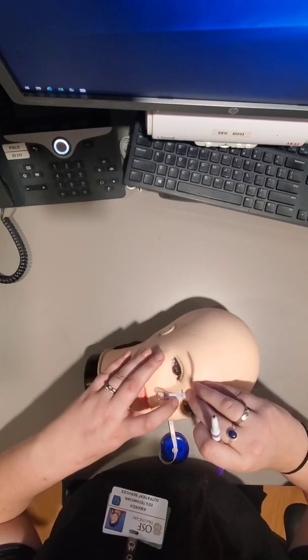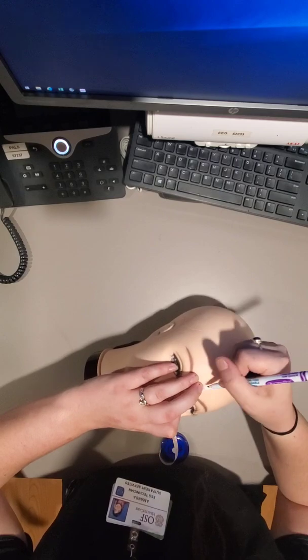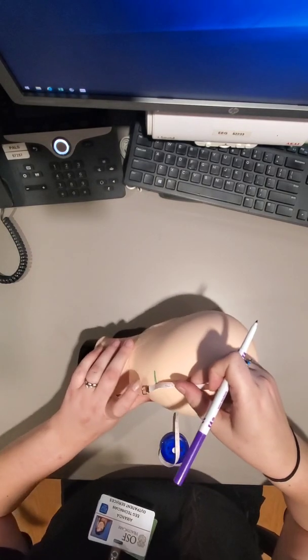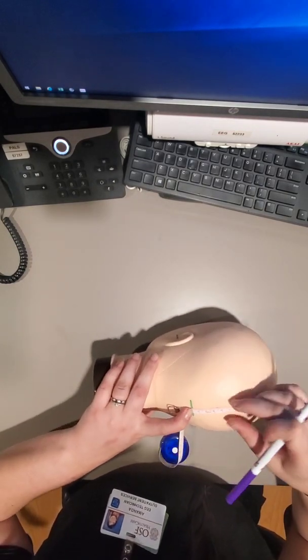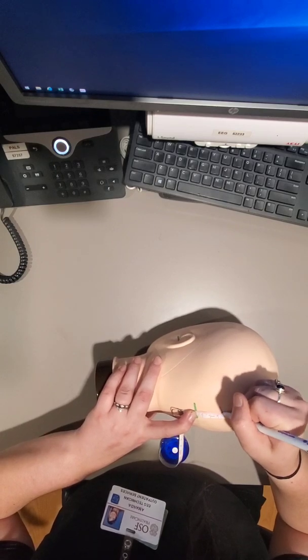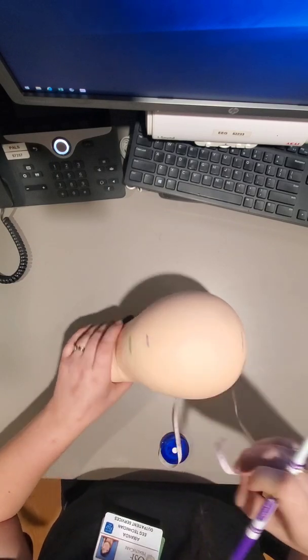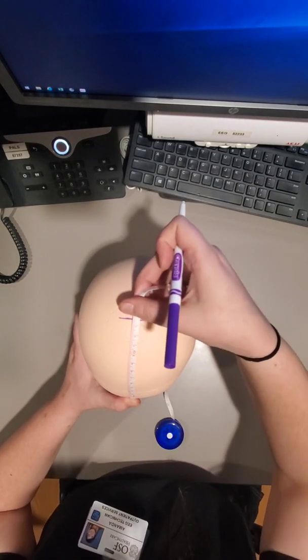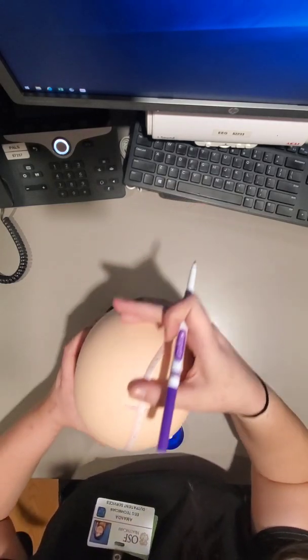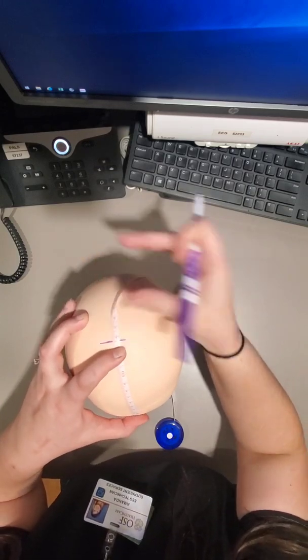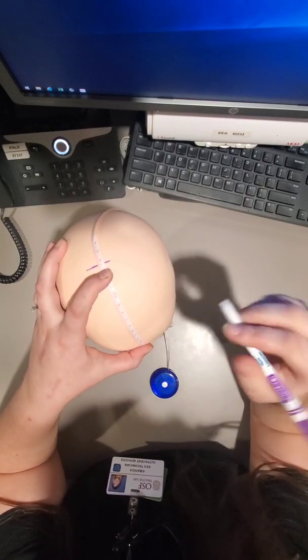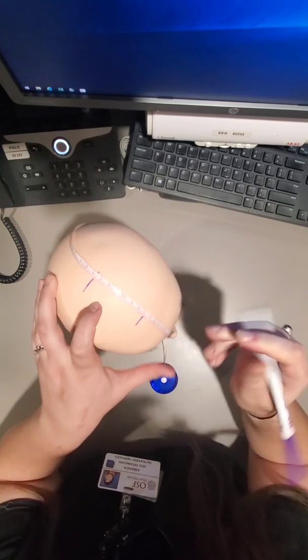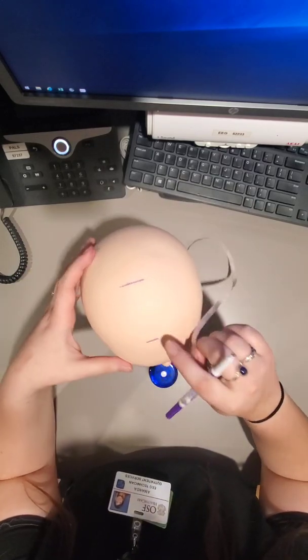I'm going to make FPZ mark at 3.4. I'm going to do the same on the back with the inion. Now I measure FPZ to CZ, 13.5, 13.5 divided by 2, 6.8. And that's my FZ.